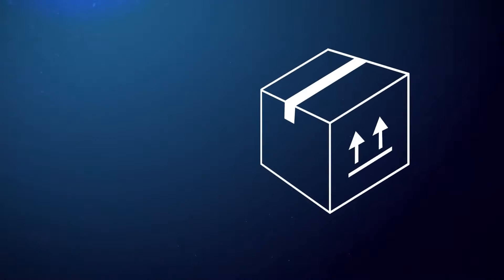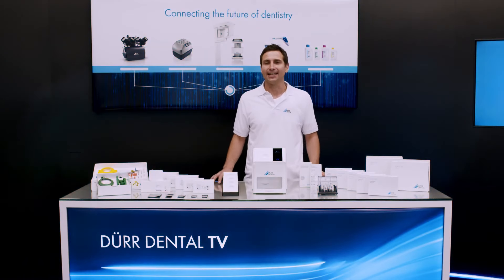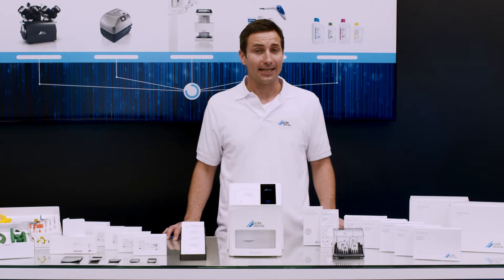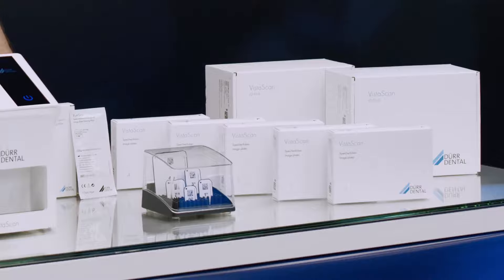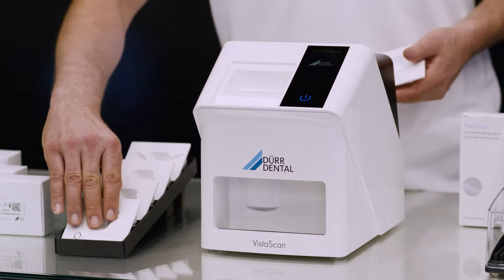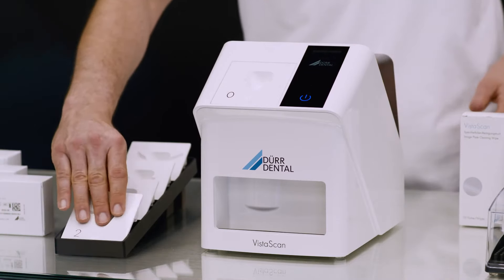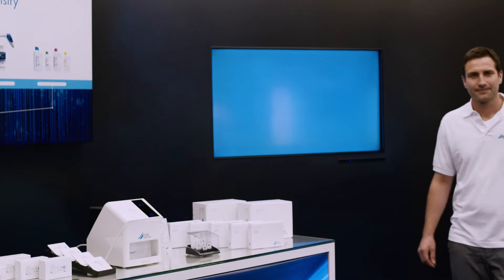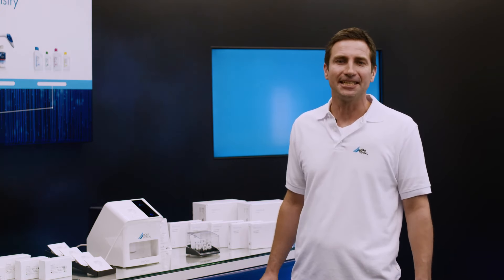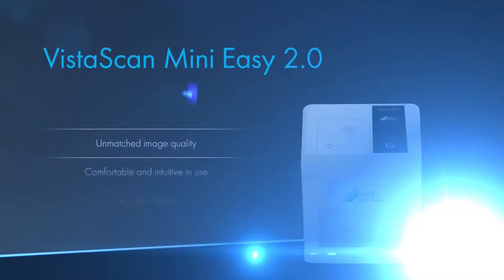The VistaScan MiniEasy 2.0 — the most intelligent MiniEasy that ever existed. A comprehensive set of included accessories ensures a smooth start and effective workflow from day one. As the VistaScan MiniEasy 2.0 can digitalize all intraoral sizes, image plates and light protection covers are also available in sizes S0 to S4. By changing the plate guides, the image plate format to be read in can be changed very easily. If there is little space available in the practice, the VistaScan MiniEasy 2.0 can also be mounted on the wall. The VistaScan MiniEasy 2.0 — unsurpassed in image quality, with glass display, the Easy Feed concept and the intelligent automation features based on VistaSoft AI.